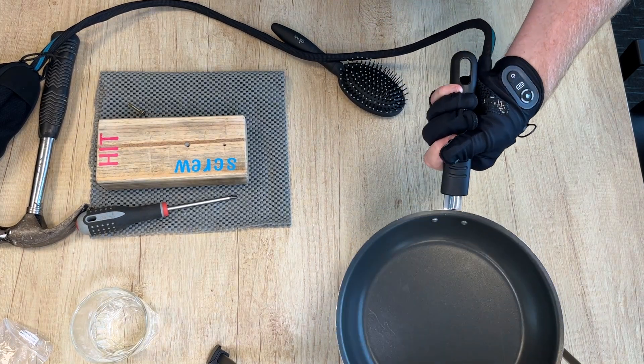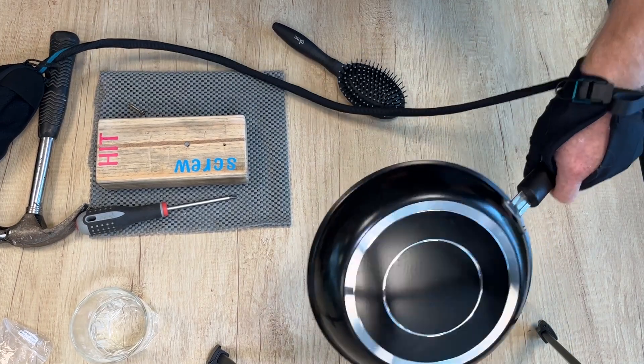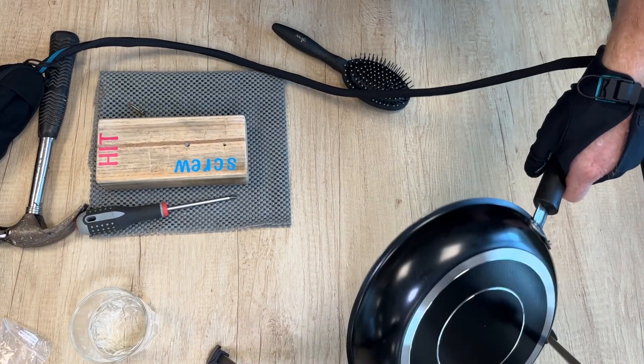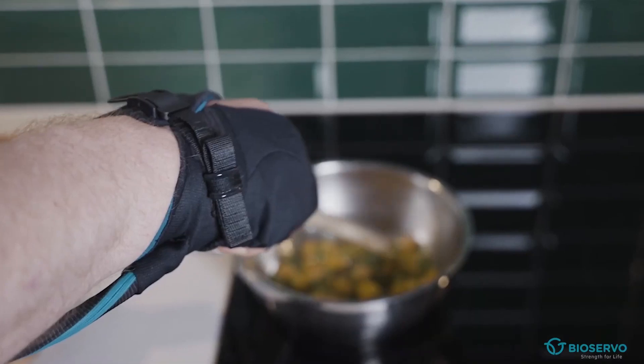We've got mechanics working with the Carbon Hand and going back to work, as well as people working as chefs — really challenging what they can do with the extra power and endurance it provides.